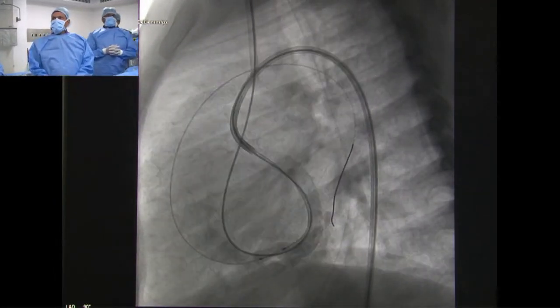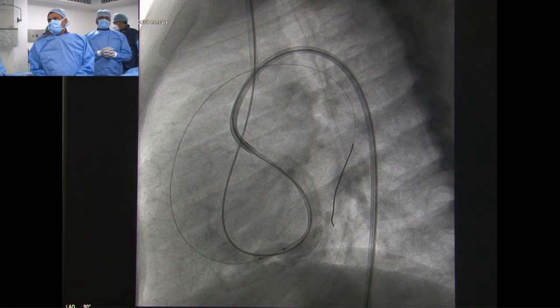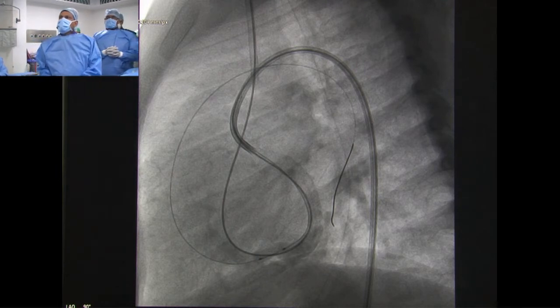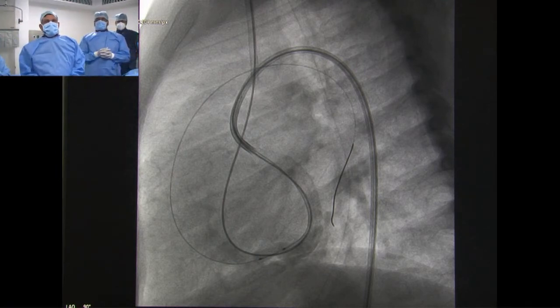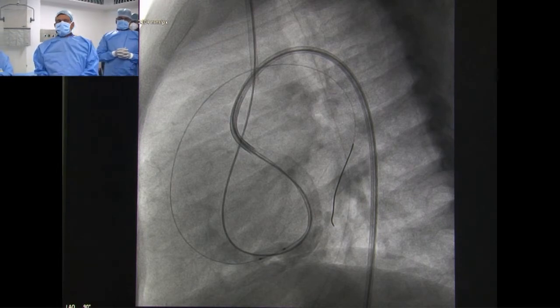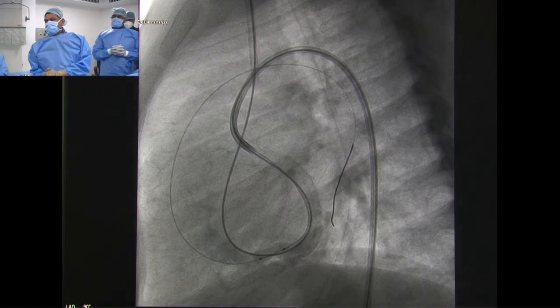Yeah, that's a reasonable option. You want to go through the vein or through the artery? We want to go through the artery. Why did you take 6? You could have taken 5. This is a small child, right? You could have taken a 5 guiding catheter. Yes, it is a 10 kilogram, 18 month baby. I do agree with 5. A 5 will take a 7.5 Conar MF device as well. But 6 was taken at that point of time.